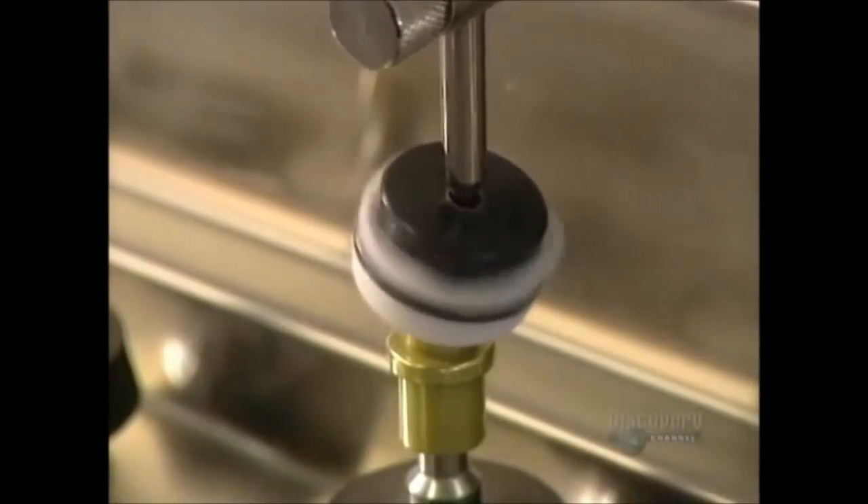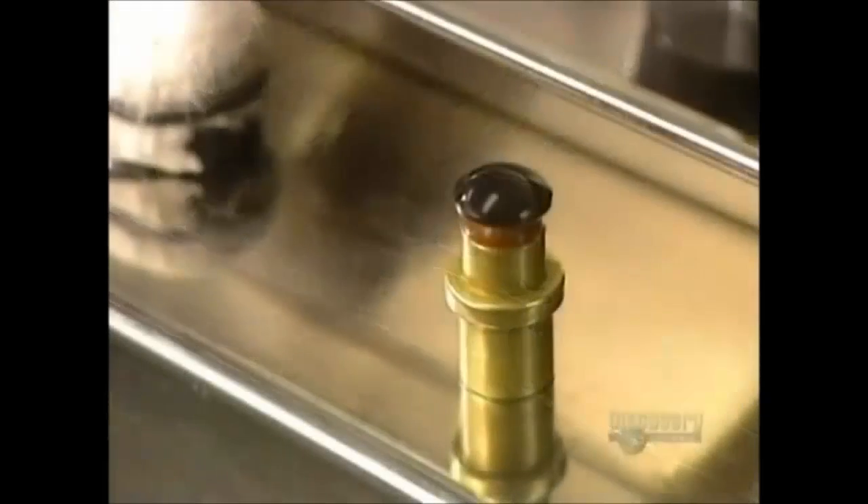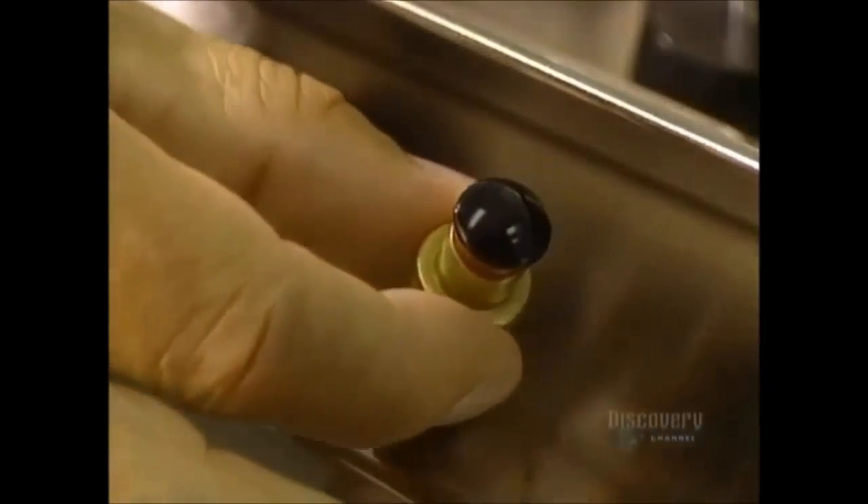This apparatus polishes several lenses at the same time, a step that takes only 60 seconds. With everything computerized, quality is incomparable. A technician then polishes the rims of the lens.